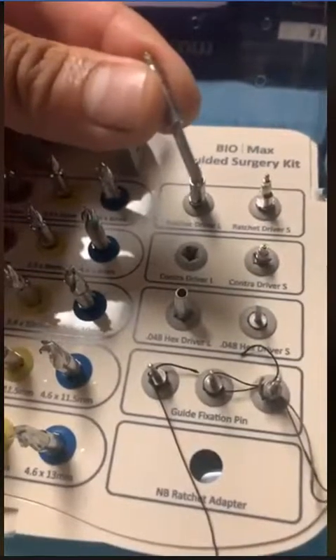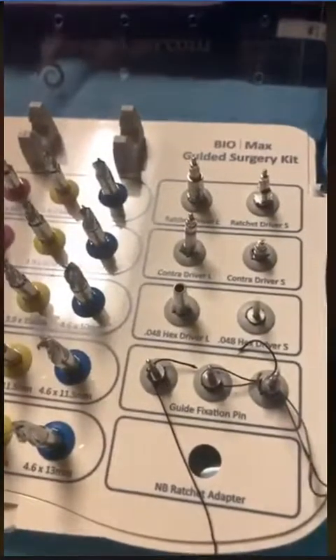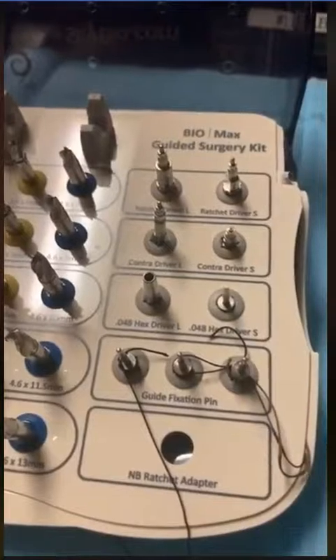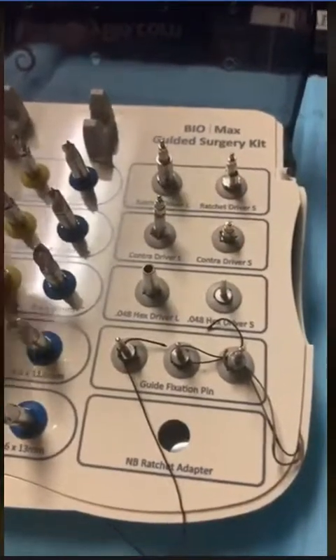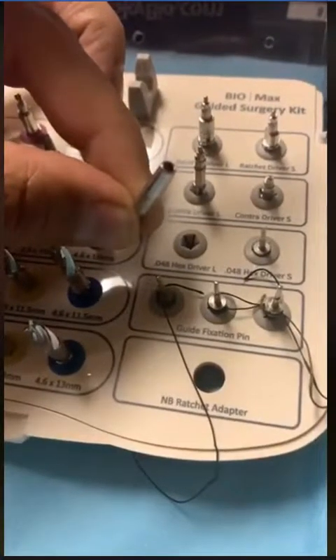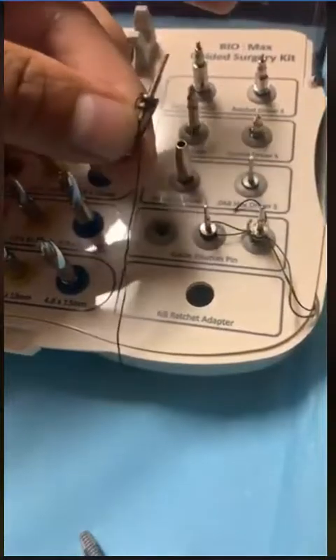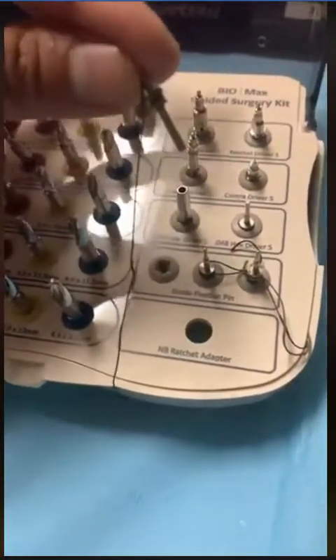So this I purchased directly, and I put it in here because I modify, and I don't know about you, but any implant system that I have worked with, I have modified and added more stuff into the surgical kit that I need. For example, this kit does not come with an extender. Don't ask me why, it doesn't. I buy an extender and I put it in here. Now you have 3 paralleling pins for a startup of a 2mm on one side and a 2.5 on the other side, so you could switch it around.